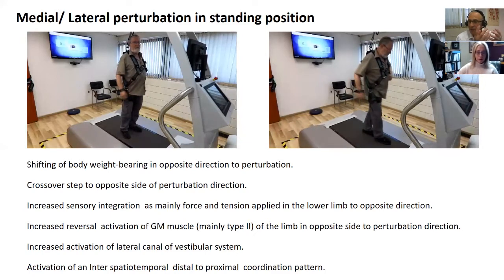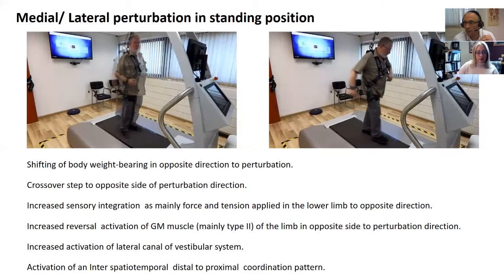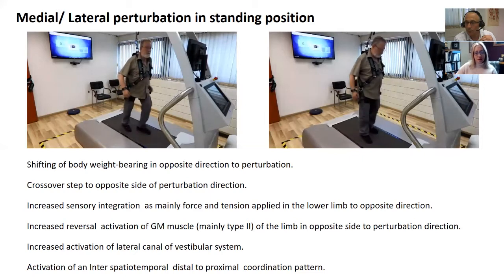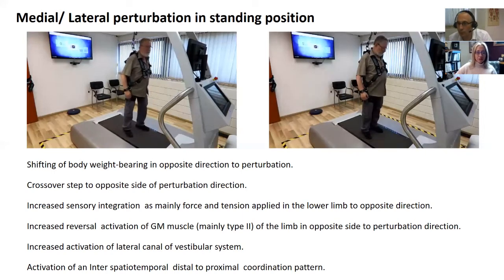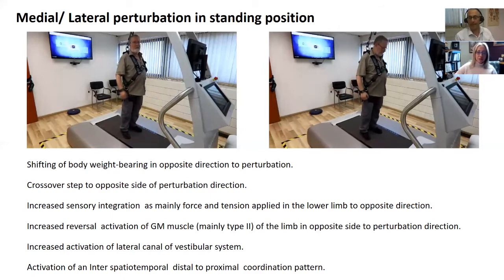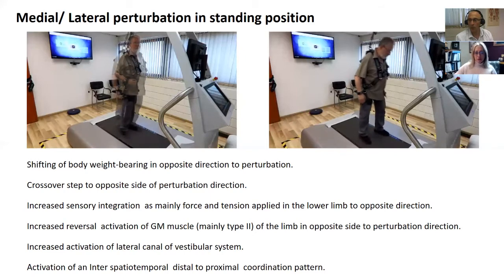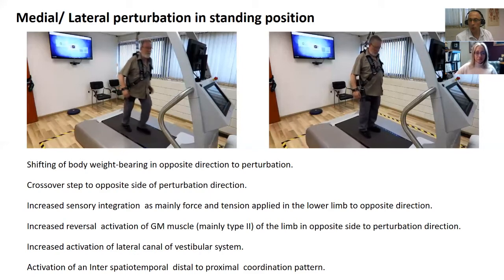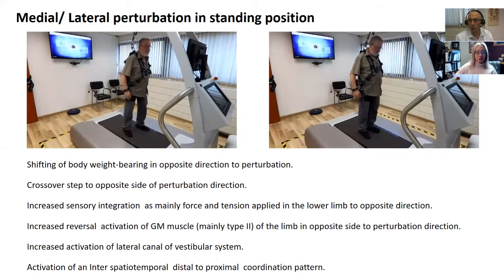Do you have any comments on how to better describe that at all, Amy, of what's actually happening in that right hand pane? Yeah, I think that's exactly what's happening. I appreciate the fact that we can very specifically target a muscle group to coordinate his efforts in trying to take that stepping response. So I am impressed by the way he can actually take a step with his right foot. But it's more that video on the left where he has to go, his stance phase, he's just standing on that right leg that it appears unstable. So it just shows where his deficits are, even with a small perturbation, but we can control that. And I like that. It's great.